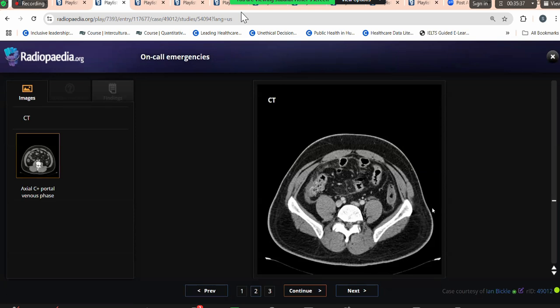Other possibilities would be infective etiology if there is any previous history, like tuberculosis or amoebiasis could affect this region. The terminal ileum is not involved, therefore I am keeping tuberculosis as a less likely differential.